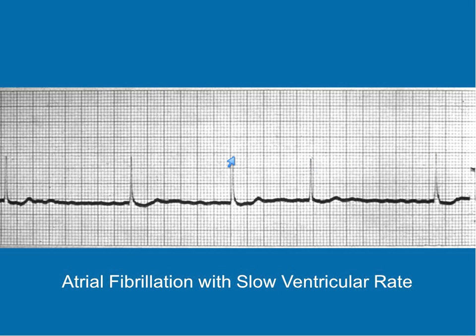Now, with atrial fibrillation, the 1500 method wouldn't work because if I took this and measured and divided it into 1500, what I'm assuming is that every beat has this distance. So when every beat is different like this, then you are left with counting the number of complexes in a 6-second strip and multiplying it by 10 to get a heart rate.